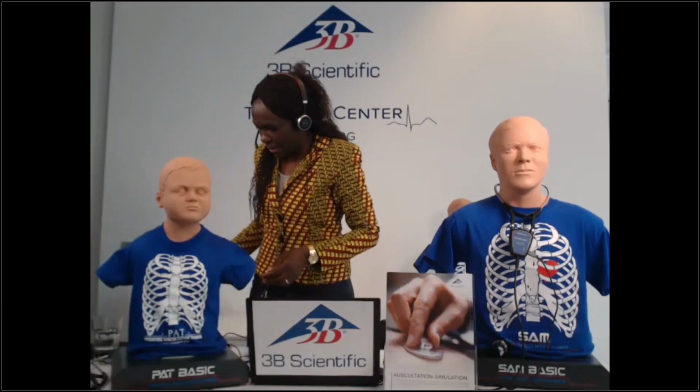The next thing that you get in your delivery content, we provide you with the software. It comes in a CD form, and usually you can also download this and import it to your computer. So you can copy it in a USB stick. We are trying to improve that, and we are hoping that in the next deliveries, we'll use a USB stick for that. So currently it's a CD-ROM, and you can play this on a USB and just plug it into your computer.